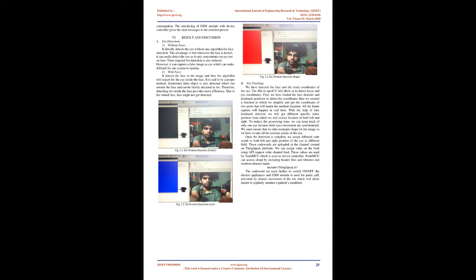B. Wireless communication using cloud platform. Cloud is required for data storage and also for processing and manipulating data. It has many merits, like its maintenance is easy. It has large productivity as many users can work on the same data simultaneously. For this we are using the ThingSpeak platform. A Wi-Fi module is inbuilt in the Raspberry Pi. After the processing, the code word is uploaded through this Wi-Fi module. Then the device controller retrieves the code word from the same server.